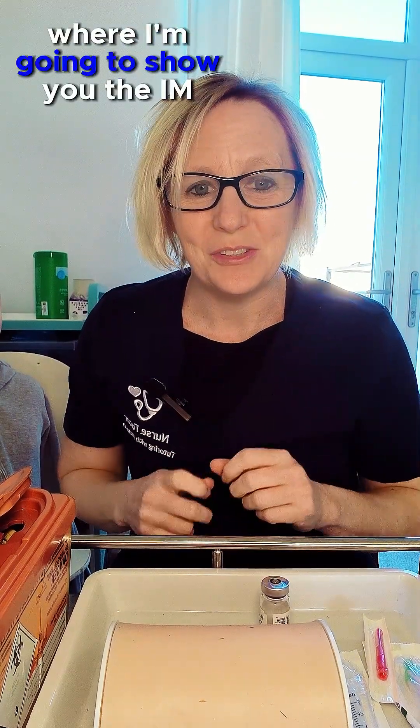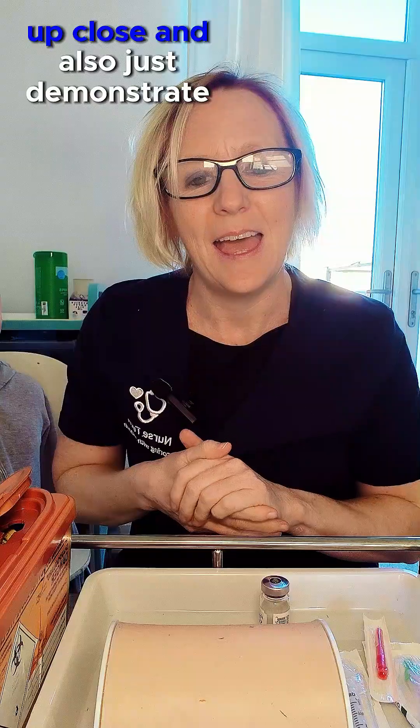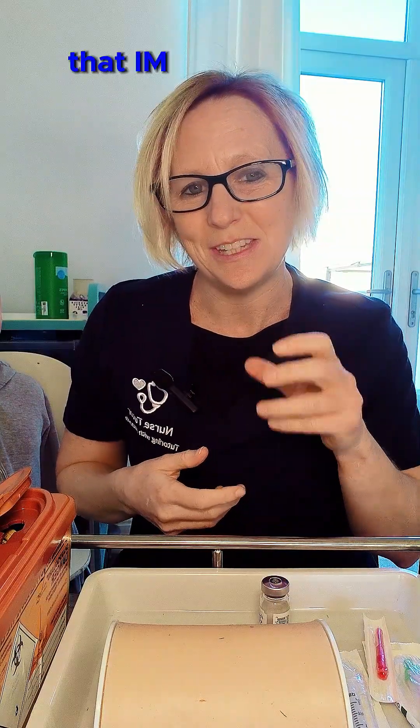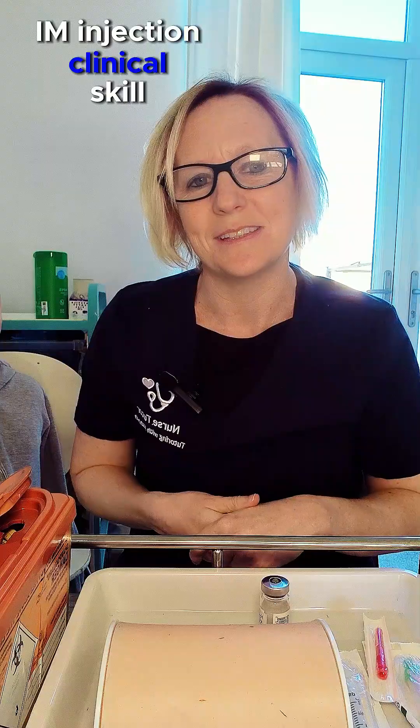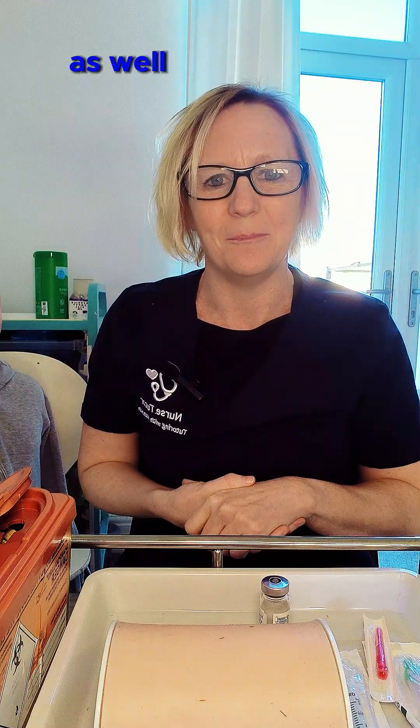Welcome to this short video where I'm going to show you the IM injection equipment up close and also demonstrate the IM injection technique for your NMC OSCE IM injection clinical skill station, or if you're a student studying for your OSCEs or for practice.